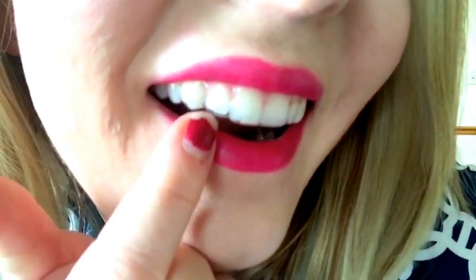I have had one small concern. I don't know if you can see it, one of my teeth here, my lateral incisor on this side, does not want to seat all the way down in the tray, and I asked if that was going to be a problem. They looked at it and said that it was still technically within the realm of normal, so they said just to keep an eye on it and make sure it doesn't get worse, and it hasn't. For the last few trays it's been about the same, so they said it shouldn't affect my treatment. That's the only big news for myself so far. Right there, see how it doesn't go to the bottom of my tray very well? That was the issue. But I am going to show you a few pictures here.